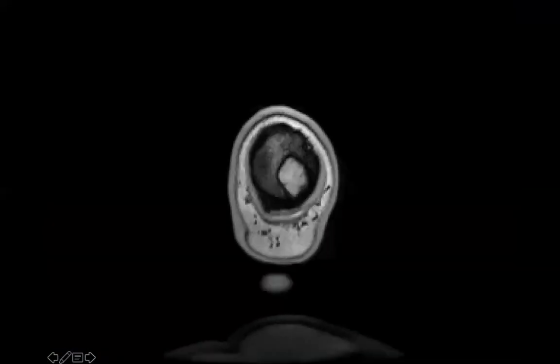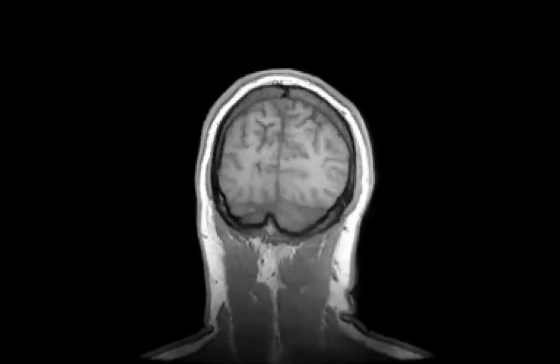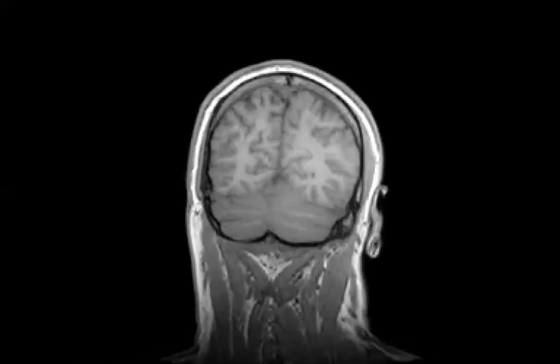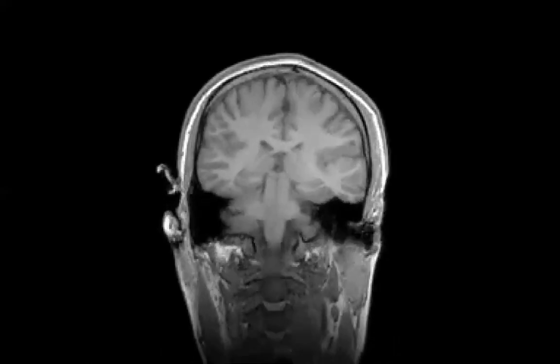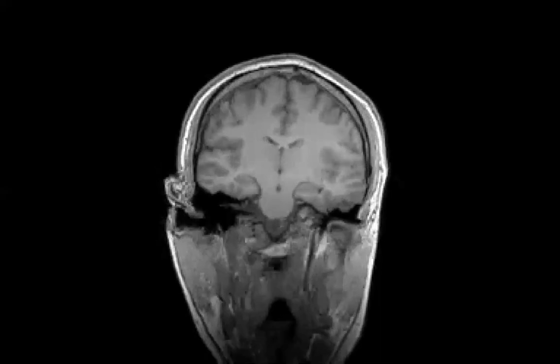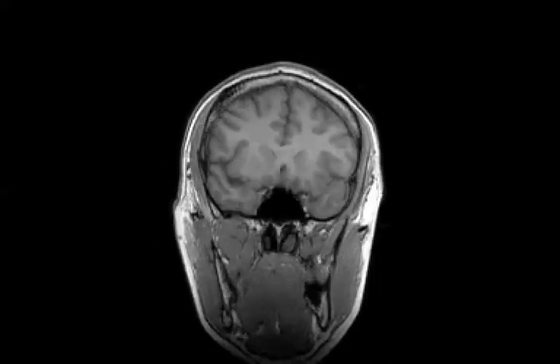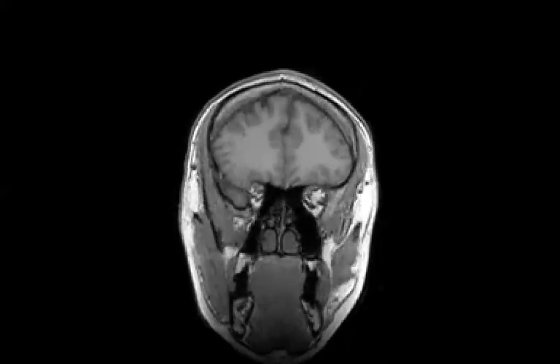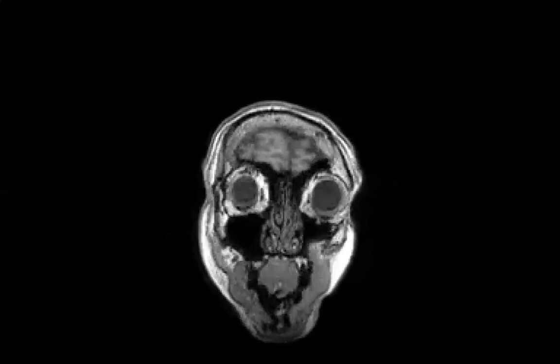So if we're following this through, this is what a typical CAT scan or MRI might look like, going down through the brain. We started at the front of the face, or the top of the head rather, and we're coming all the way down through, down to the brain stem down here. Pretty soon we're going to get through the brain and down to our eyeballs, and it'll look a little more familiar when we get there. So you can see it forming here. Here are our eyes as we go through there. So we're scanning all the way down through. So we're past that point now.